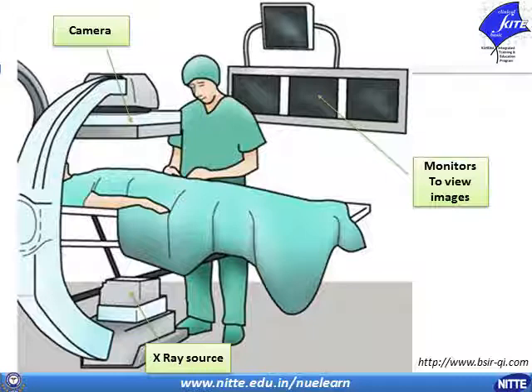This allows angiograms to be captured providing different views of the coronary arteries. There are also a set of monitors which can be used to view the angiographic images even as they are being captured, and also importantly to monitor vital parameters of the patient.